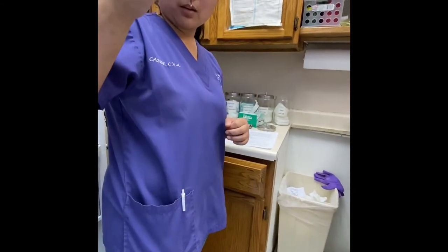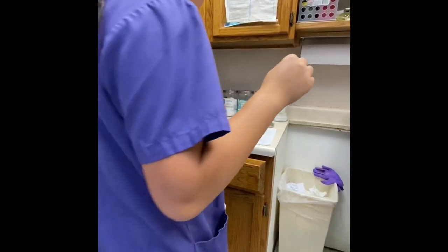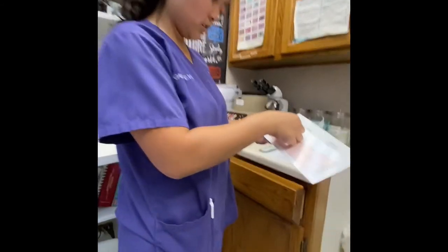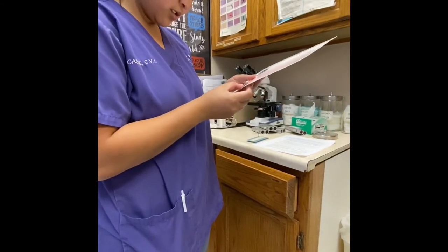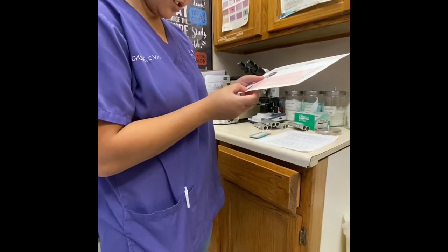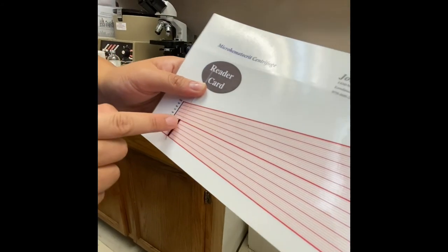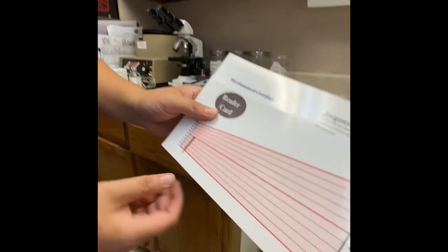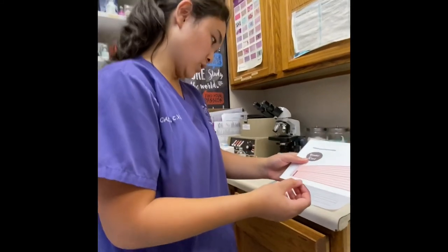Just from looking, my guessed PCV might be like a 50, but I'm not sure — I'll go ahead and double check. I have my card reader right here. I'm going to get it to the bottom of the clay and try to get the top of the line right there. Yep, it looks like it is 50 — maybe a little bit less, maybe like a 49. And that's it.